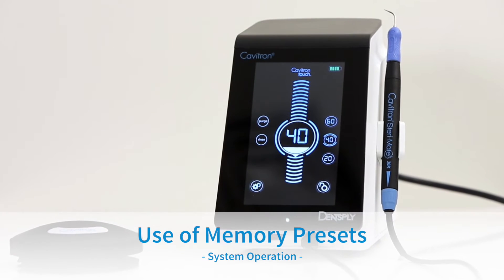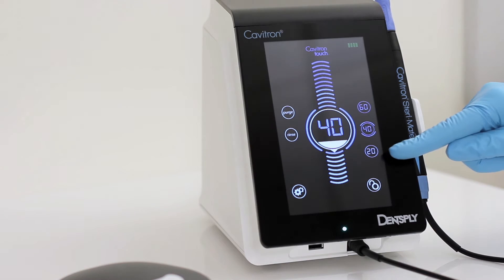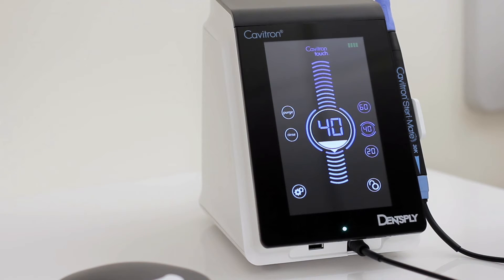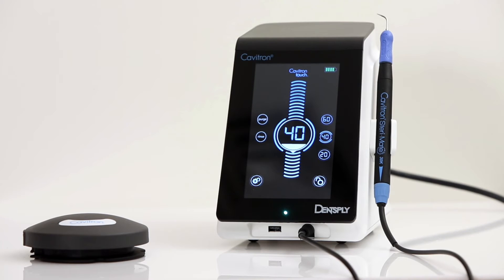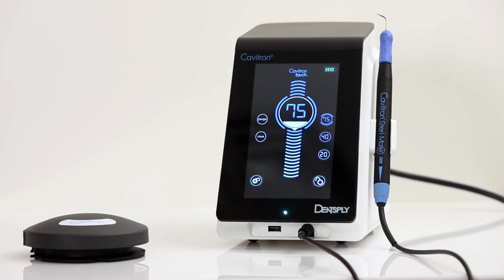Use of memory presets. The user can adjust the power level for increased power. 3 power preset options are available. The factory settings for the presets are 20, 40, and 60. Please adjust the power level to your desired output, and press and hold the preset button until the sound indicator is heard to select the desired preset.